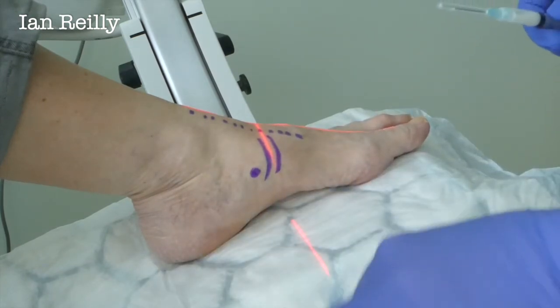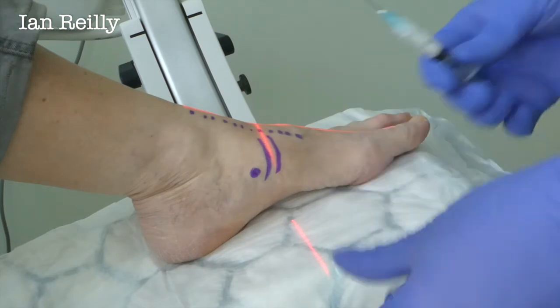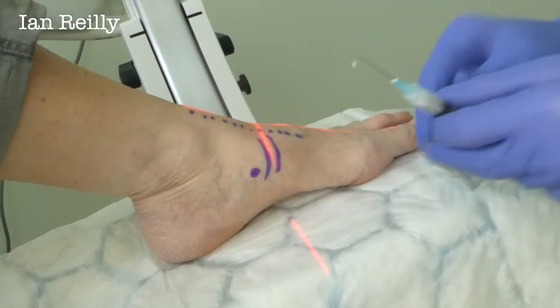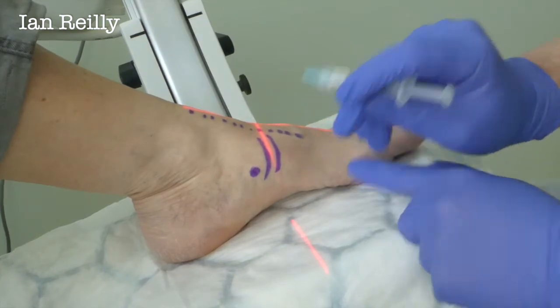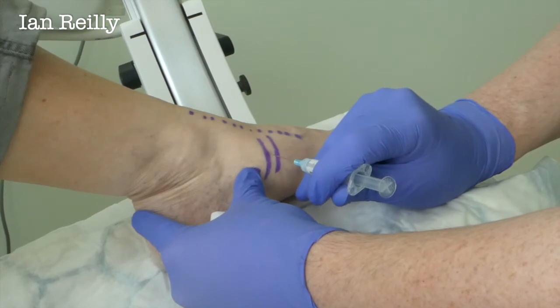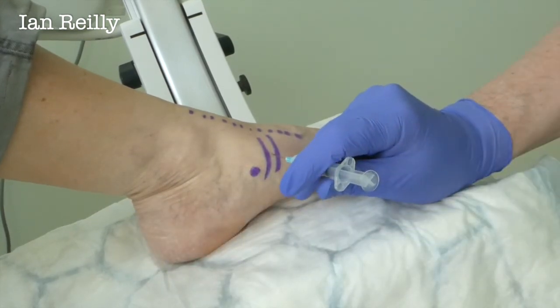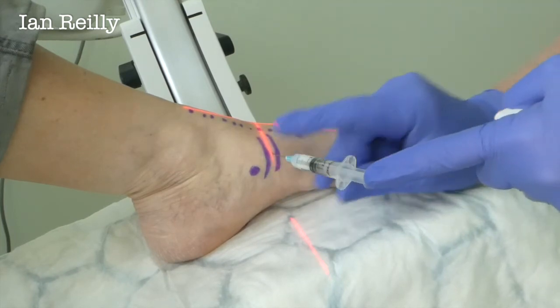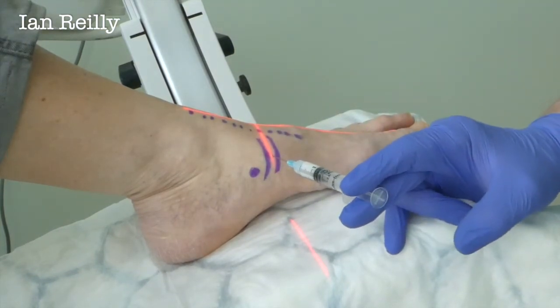We have a mix of Kenalog and some local anesthetic — that's more for the camera — and our tip post is coming there, so we're going to come in here, Kathleen. Little scratch — three, two, one, scratch. Let's put our laser pointer back on and do a little check x-ray — fingers out of the beam.